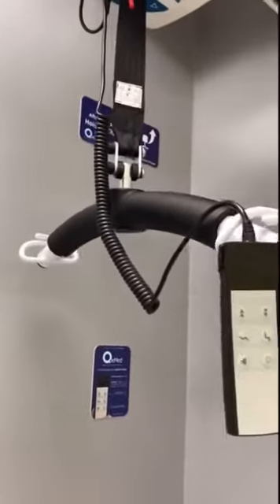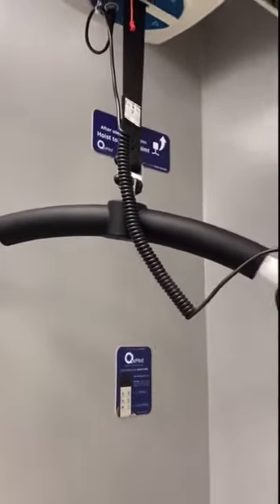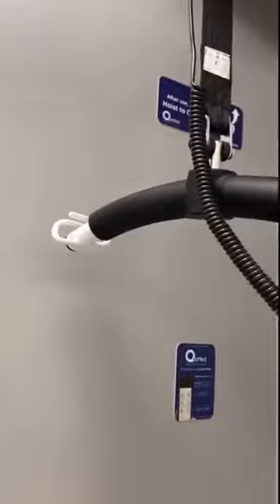The hoist is designed to be compatible with looped slings, which is what most people in the community will have, and their carers will be familiar with this style of hoist.